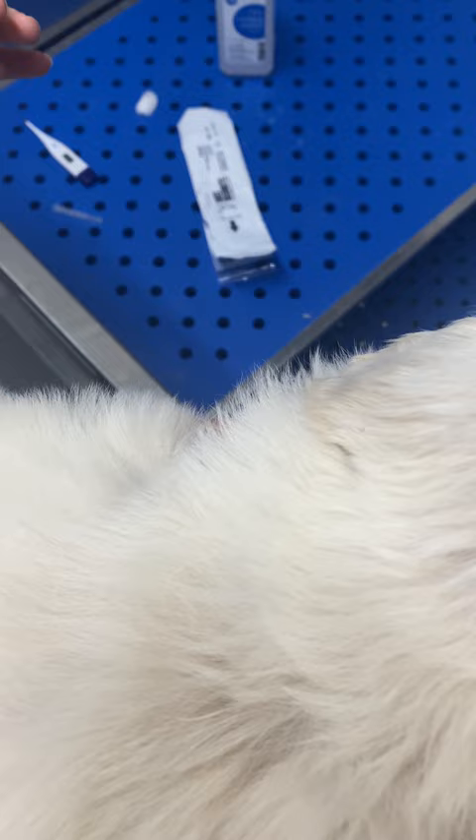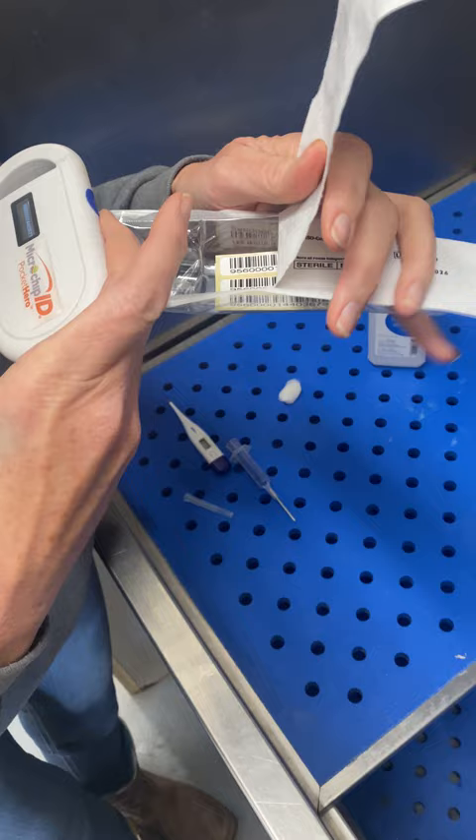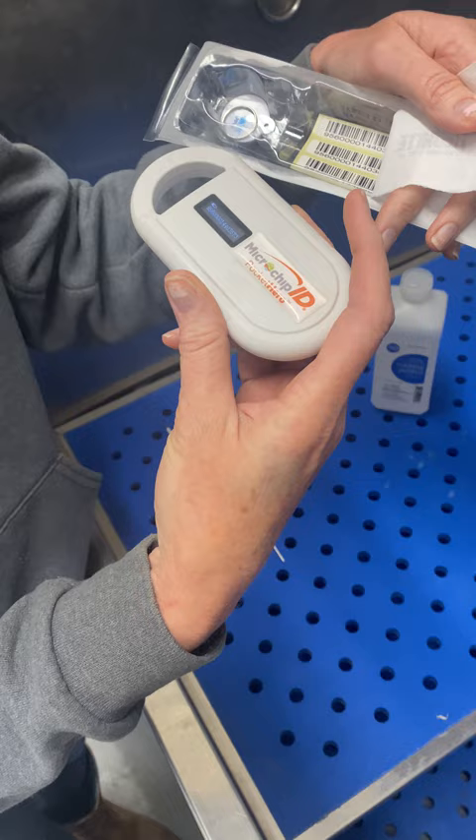Then we take our microchip scanner and get the reading. I always double check to make sure — I've never had it not be the same — but I always double check to make sure it's the same as the code that I'm picking up. Make sure there's no mistakes.